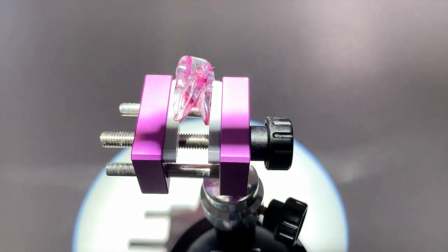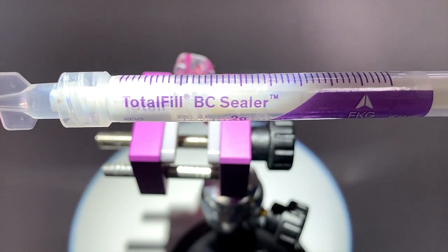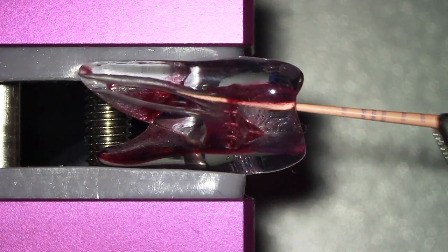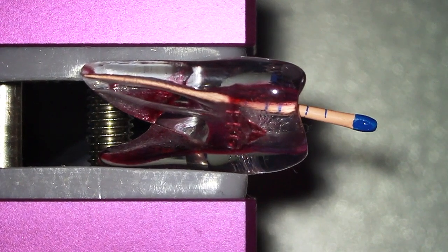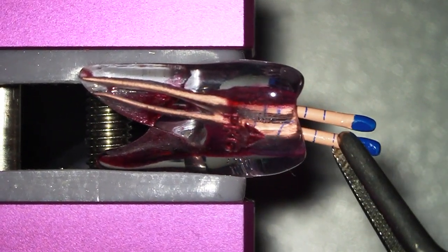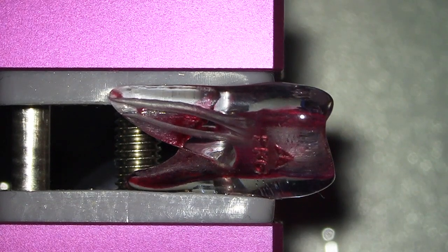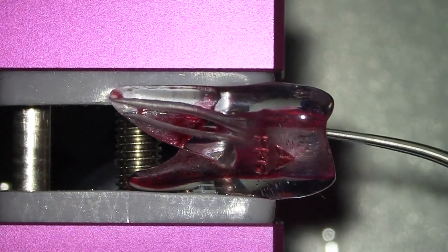We will obturate with the cold hydraulic condensation technique with the use of the Total Fill BC Sealer. Before injecting the bioceramic sealer into the canal system, make sure the gutta-percha points fit properly and adjust them if necessary. The Total Fill BC points are recommended. When the gutta-percha points fit, the bioceramic sealer is injected to both canals.